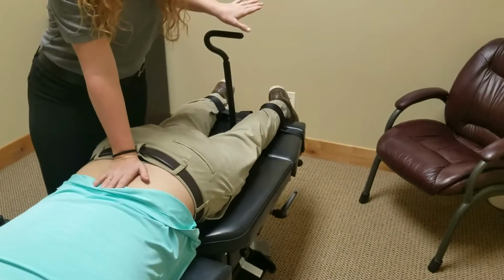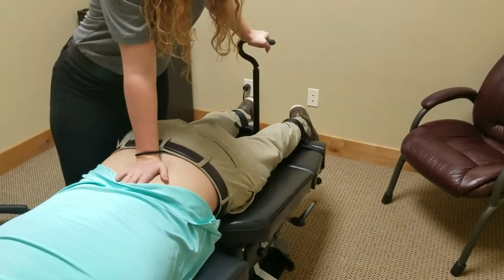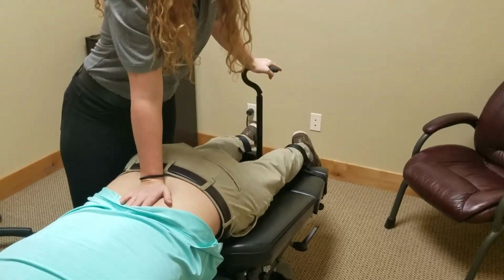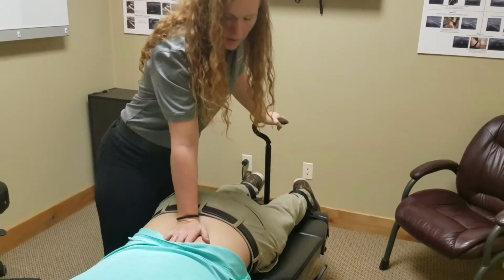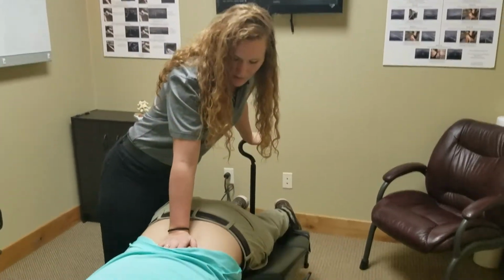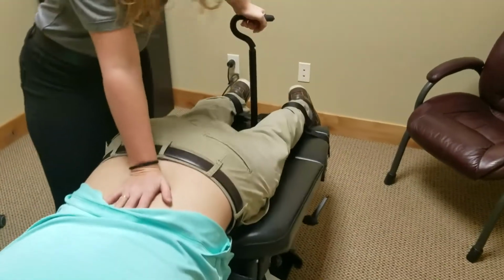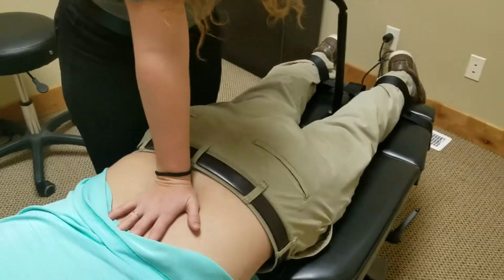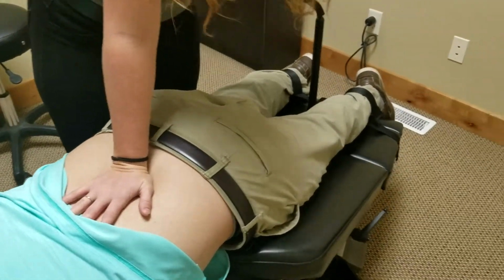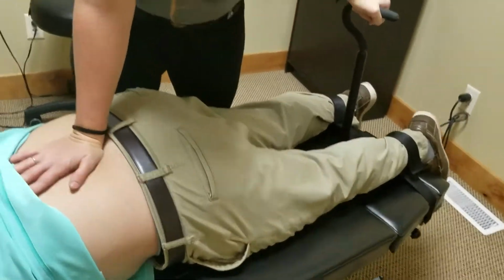I've already unlocked the table for this video. And while I open up this space and help get some pressure released through those lumbar discs that get compressed very, very frequently, this is super helpful for someone that has disc compression that may be causing nerve pain that goes down to the leg, sciatic pain, and helping to relieve that pressure.